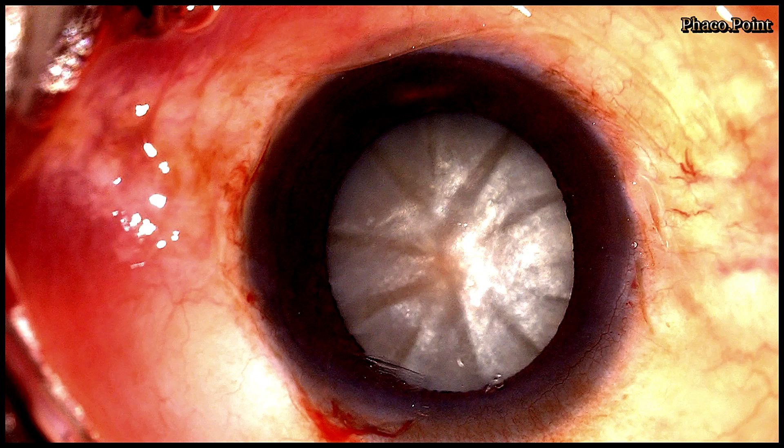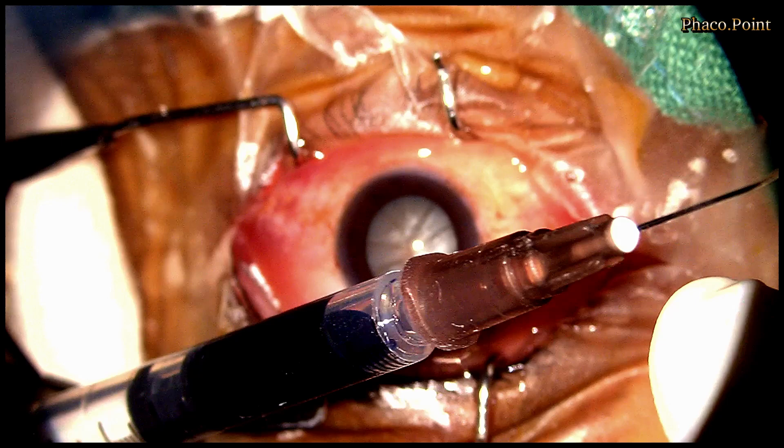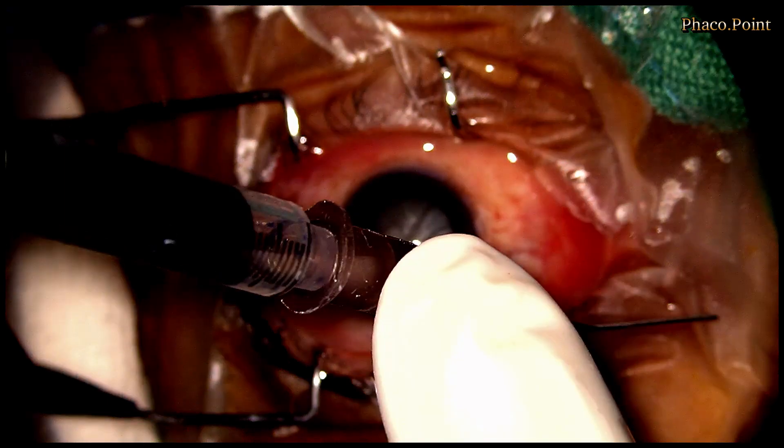As I mentioned earlier, there can be no compromise in staining these anterior capsules with blue dye. At our centre, we aspirate a little bit of blue dye into a 1cc tuberculin syringe and draw it out a little more, leaving some air in the anterior part of the syringe. When we turn it around, you can see that the air does not get displaced by the blue dye.